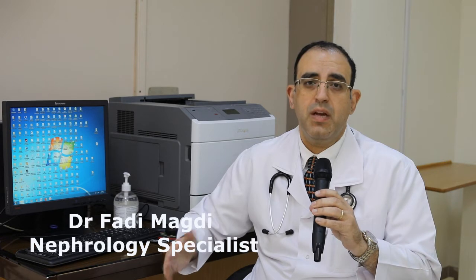So I wish that we can apply all this for all patients, and now we are informing patients and giving health education to the patients to be acquainted with this fact, so that they are fulfilling the full 4 hours of hemodialysis and not skipping any hemodialysis session to achieve a good time and a good clearance by using the appropriate hemodialysis filter or hemodialyzer to get the 1.2 or 1.4 Kt/V target.